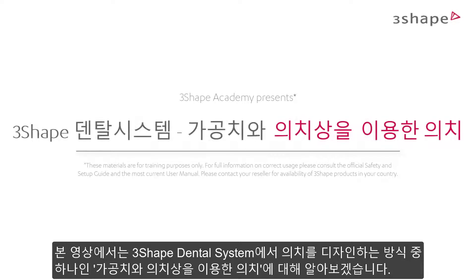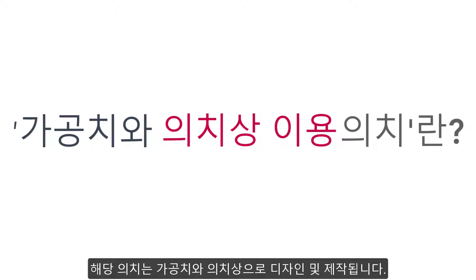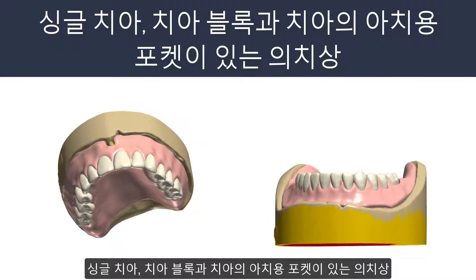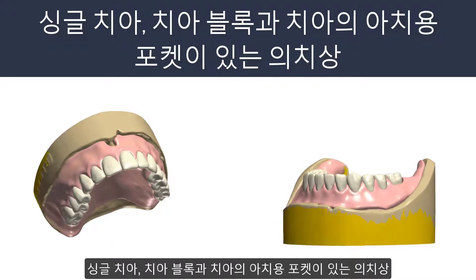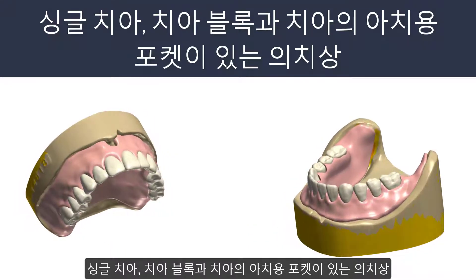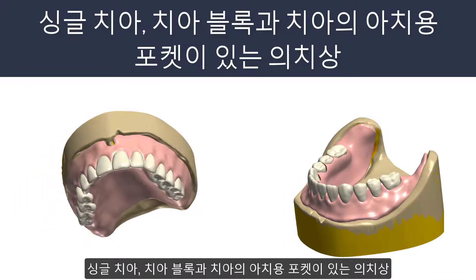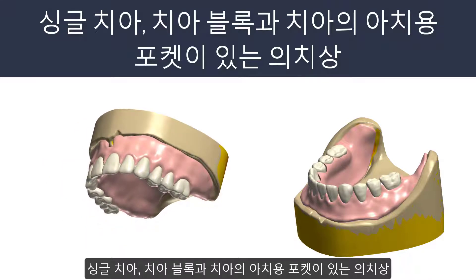In this video we will introduce you to the Base with Design Teeth, which is one of the assembling types when designing dentures in the 3-shaped dental system. This is a type of denture restoration which is designed and produced as two pieces: the base with the pockets for single teeth, the teeth blocks and arches of teeth. The used teeth are modified with the help of additional tools.